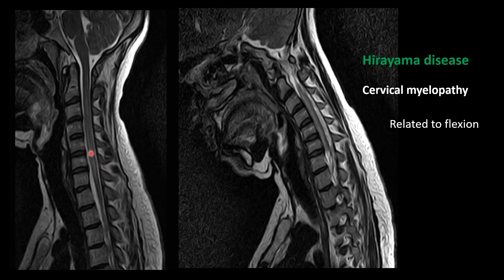In this image there is some T2 cord hyperintensity in the cervical spine, indicating cervical myelopathy. On flexion, there is T2 hyperintense soft tissue causing mass effect on the spinal cord and pushing the cord anteriorly. The anterior epidural space is effaced.